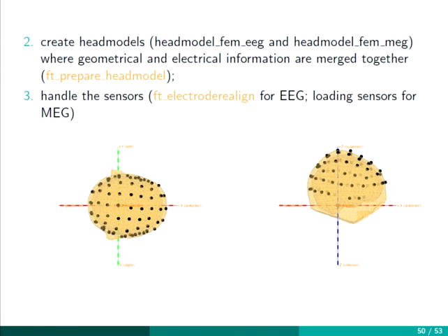Plus, there are systems that you can use, this Polhemus system. Yeah, this is to acquire the positions. And this is not about co-registration. It's about the correct acquisition of the electrode positions.